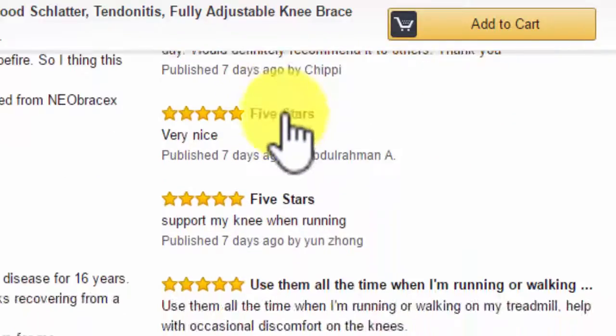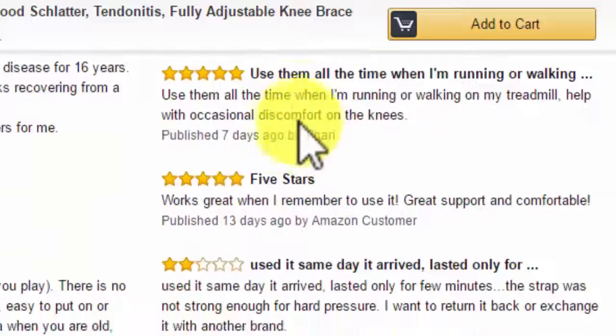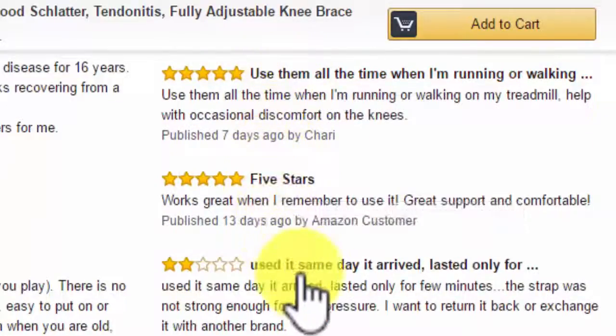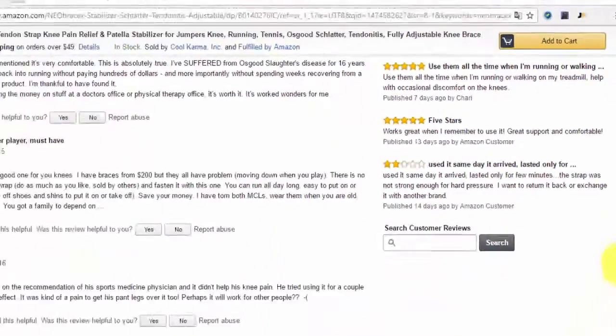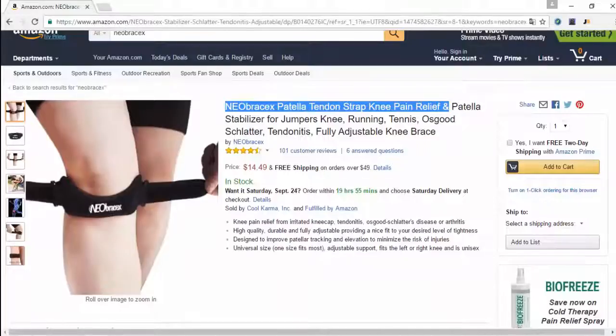We definitely recommend it. Five stars, five stars — I used it all the time when I'm running or walking. Five stars. And then somebody else used it and it lasted only for a couple of days, but we did replace that one because we do have a 100% satisfaction guarantee. In the end, all you have to do is hit the add to cart button and get yourself your new Patella Tendon Strap.